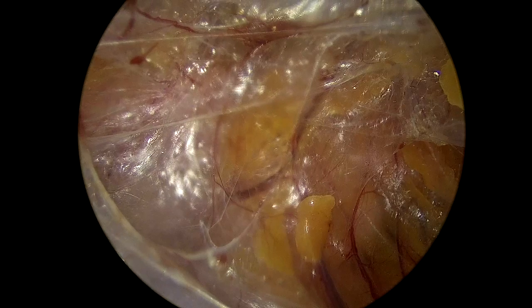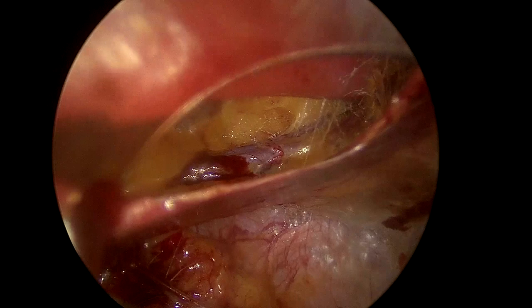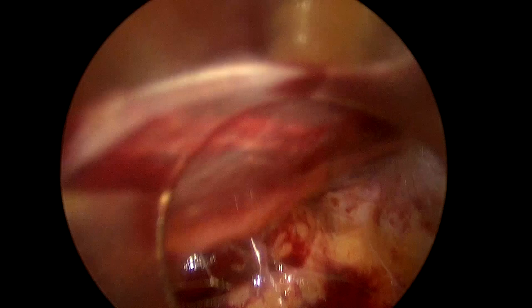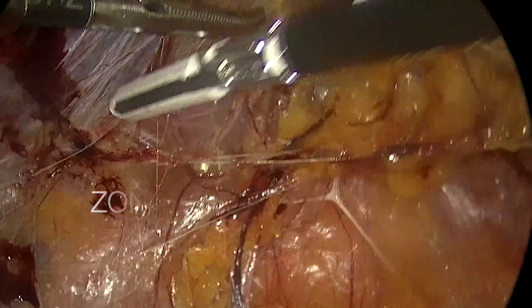I pulled the lens a little bit backwards, and then you see the fascia transversalis that I accidentally opened — the wrong plane — and the right plane where I want to go to. Just to illustrate the planes a little bit, I put in the needle, placed my left-hand trocar, and then my right-hand trocar. Here I am doing the dissection on zone 1.